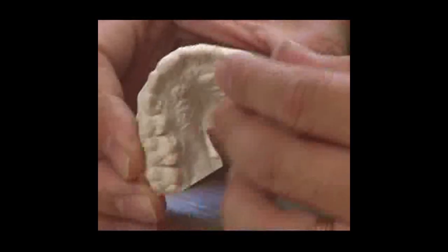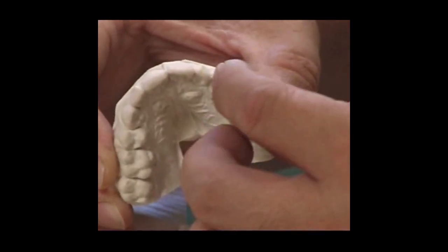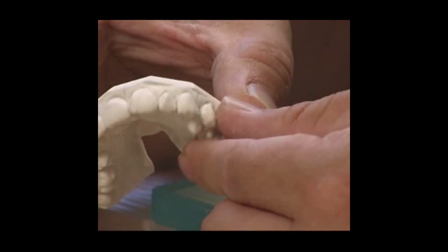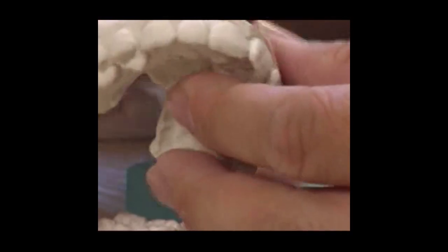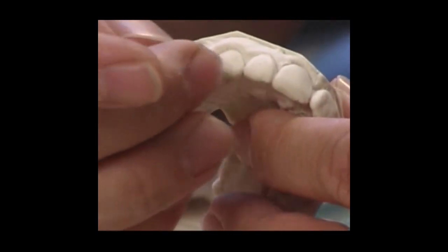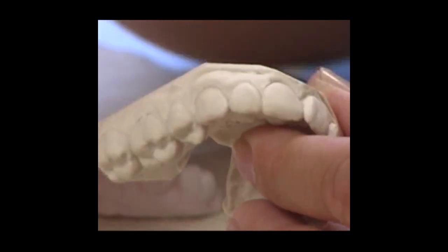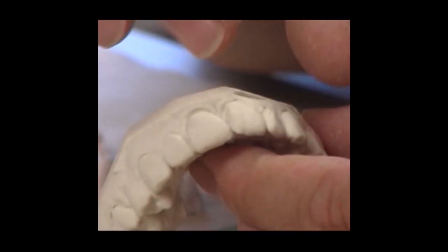And also it has a crowded situation, like number 10 is far behind here, so we want to bring it out to have it even looking. And this side is a little wider, so make this cuspid come over a little bit, or vice versa. We're going to try to compensate the width between the left side and the right side.